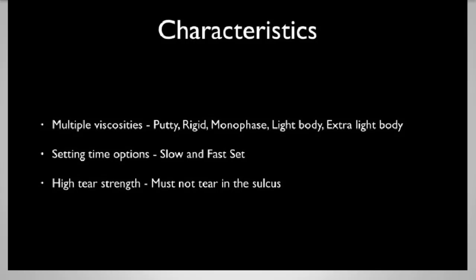The reason I like to have multiple viscosities is because I want the right viscosity for the job to be done. I use each viscosity differently. In addition, I want both a slow and fast set, and I want a material that has a high tear strength. So in terms of viscosities, in my office I'll have a putty material, or rigid, a monophase, a light body, an extra light body, and I use all these differently depending on what I'm doing.